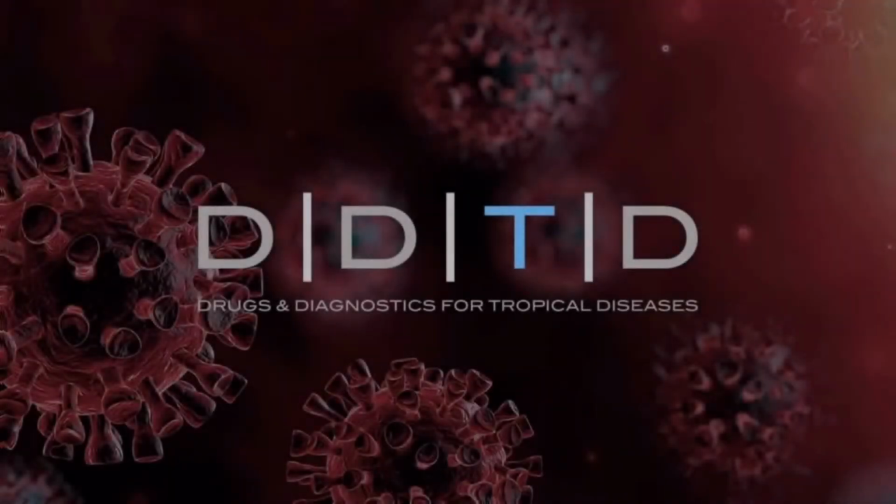The Buruli Ulcer Rapid Diagnostic Test, RDT, is intended to detect the active infections of Mycobacterium ulcerans, the causative pathogen of Buruli ulcers. The rapid test detects the presence of mycolactone, a cytotoxic metabolite of Mycobacterium ulcerans. This rapid test is formatted as a competitive assay.